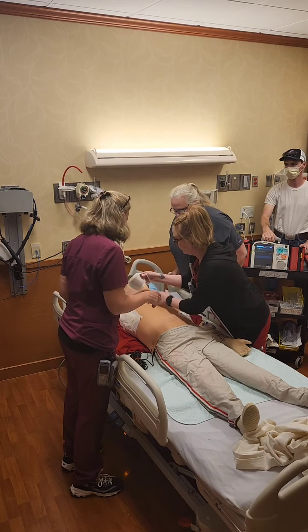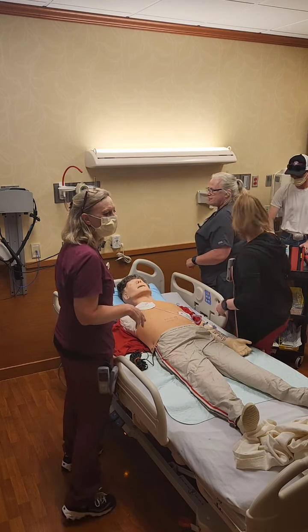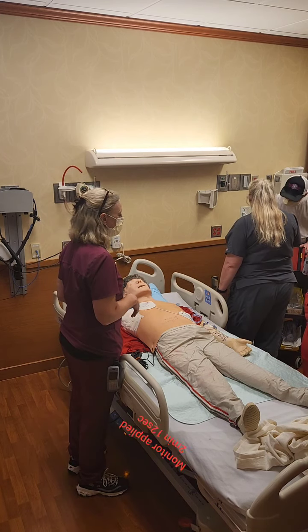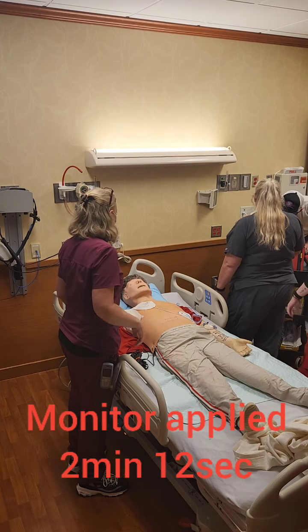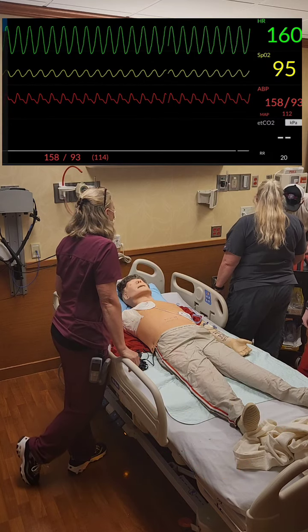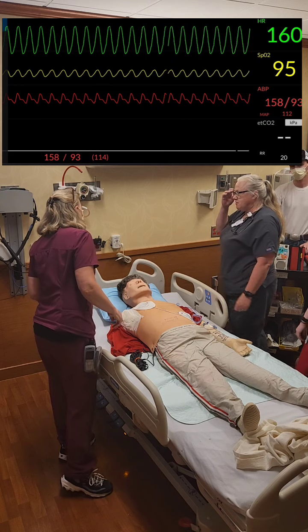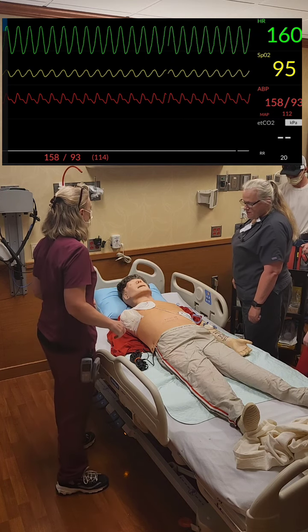Lab's here. Hey, Patty, can you switch that? You can make all those notes, whatever somebody says. You can say respiratory is here. Switch it to lead two. Alright, so that's awesome. That's the rhythm that you guys have. We've got our clock, and here are the vitals that you have.